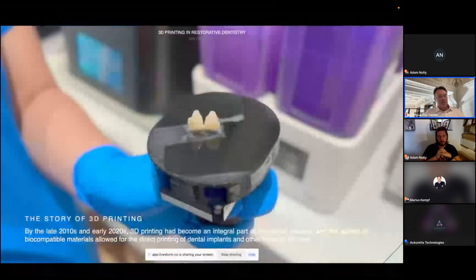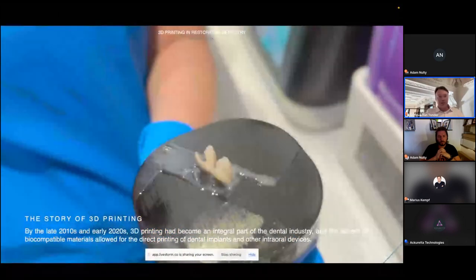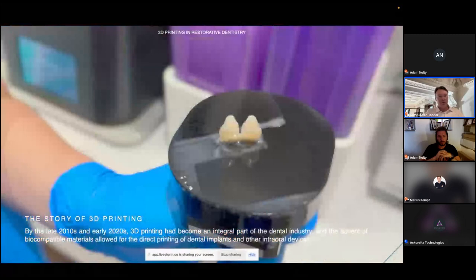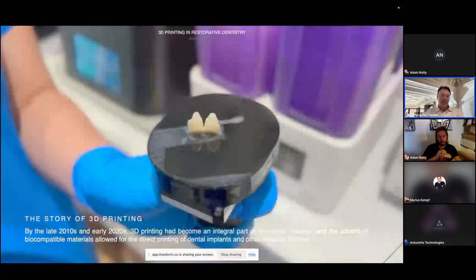In our practices, I think we use 3D printing mostly at the moment for 3D printed models to make, for example, bleaching trays and things like that. And because we can print quite quickly, we can deliver a same day result for our patients if, for example, you want to do bleaching trays.